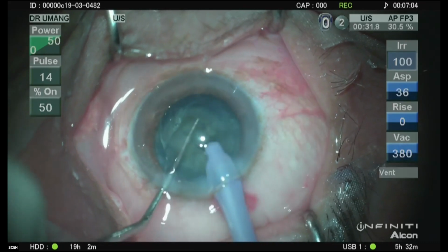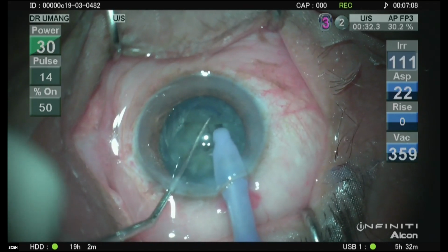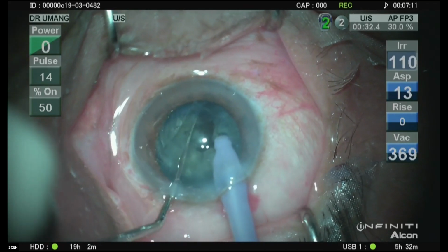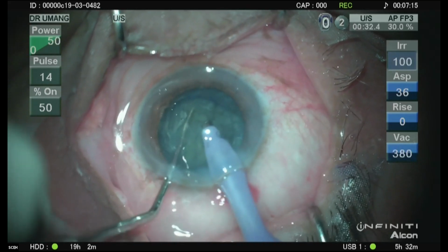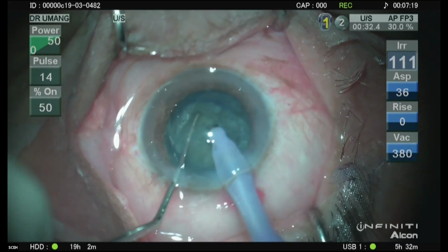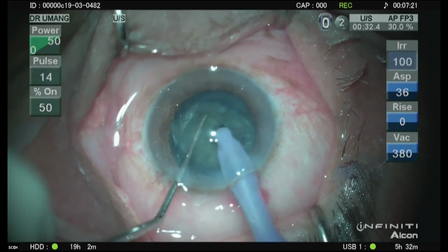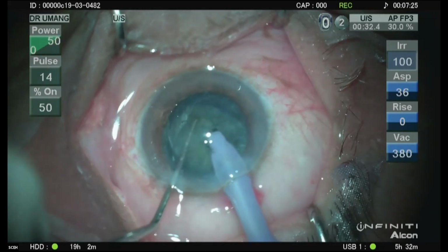Separate. One more time. And we separate. Now, the first piece generally should be the loosest, maybe the smallest piece. It's almost like a carton full of soap cakes. The first piece is more difficult to take out.